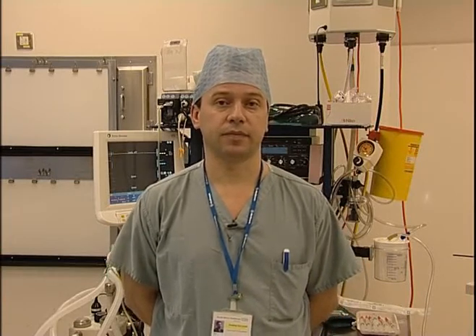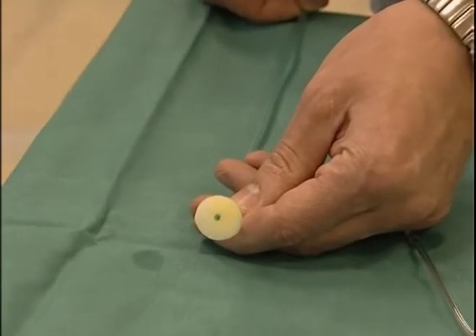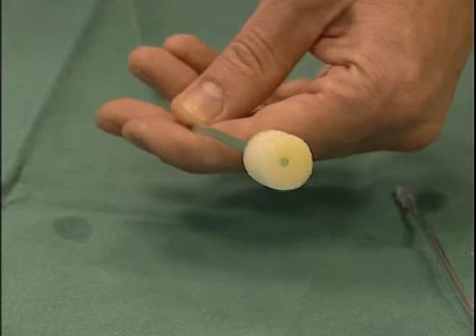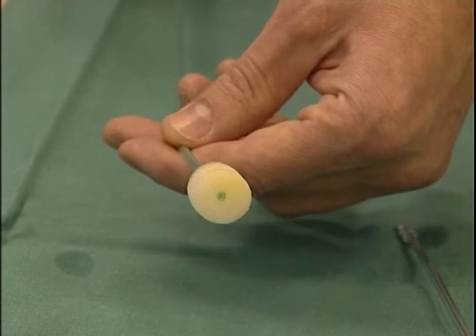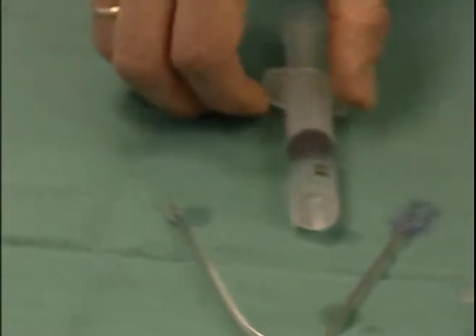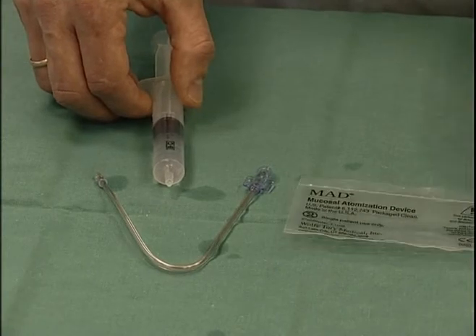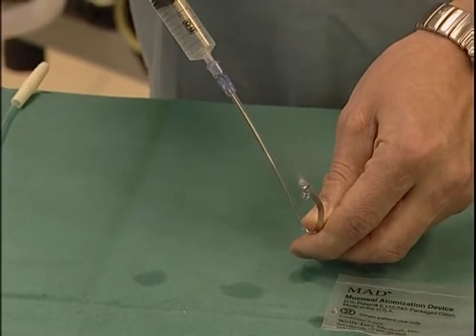There are different types of accessory equipment that may help during awake fibreoptic intubation. It is very important to give oxygen to the patient at all times during the procedure. We recommend an oxygen catheter — a single catheter with a soft yellow sponge at the end — placed into the patient's other nostril, ensuring oxygen flows continuously. Nasal specs or an oxygen Hudson mask can be quite inconvenient for both patient and operator. A mucosal atomization device can be used very effectively to spread local anaesthetic through the nostril or back of the tongue, giving a very even spray.